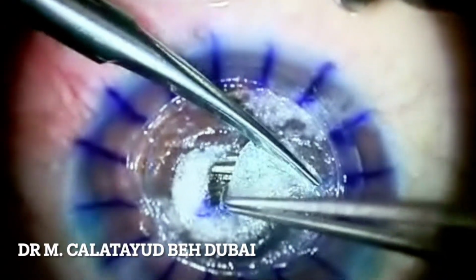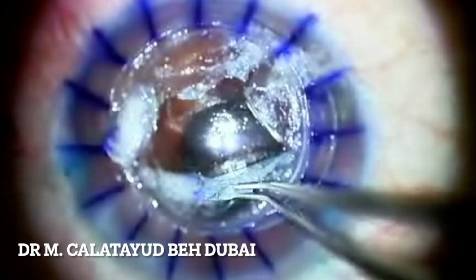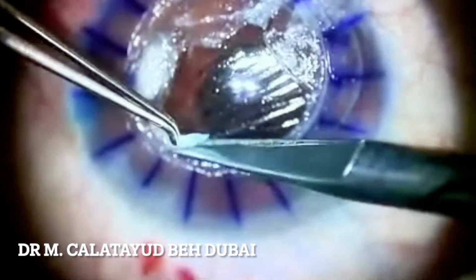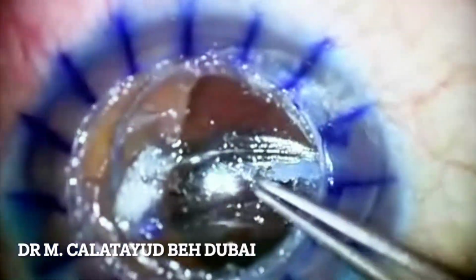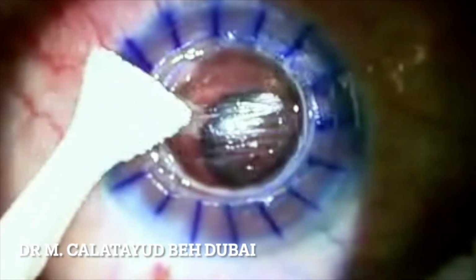The trick is to cut the stroma, always with a very soft eye to avoid puncturing the deepest layer, and dissect the periphery with a blunt instrument so that if there is a perforation, it doesn't occur open sky. Dissect and cut carefully the stroma until you find a leakage area, of course in the incision axis. Once you are there, stop cutting. In these cases, intraoperative OCT is very useful to check periphery.